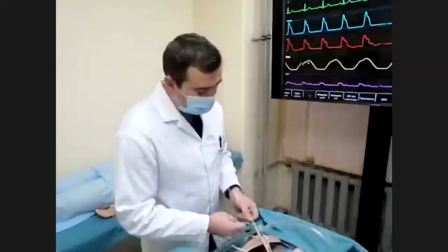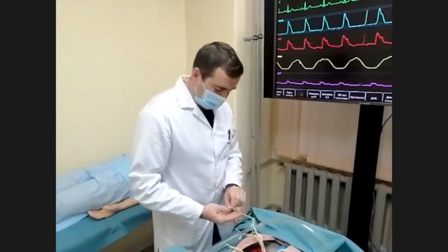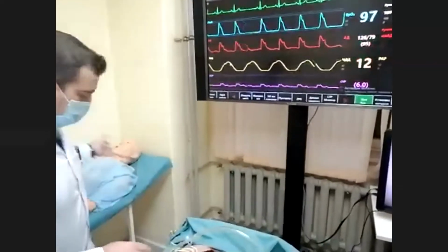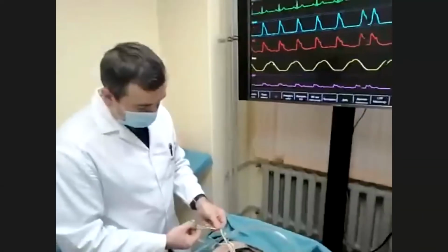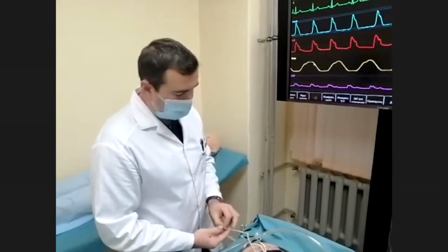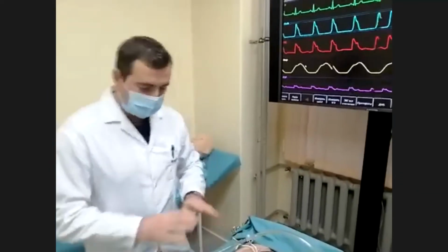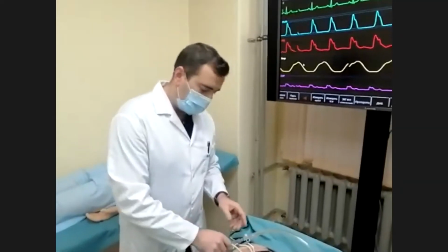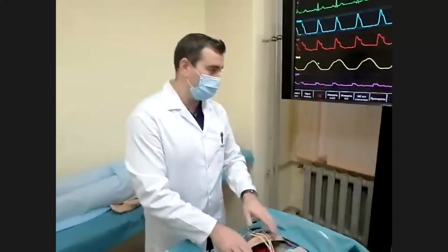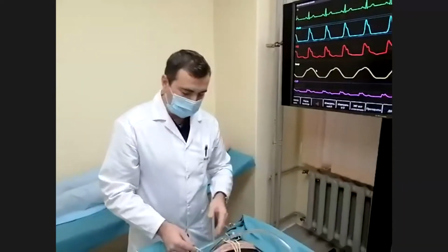It's synchronized by a human who is an operator sitting near the computer of the robot, and he watches what we do, and he is able to give us any situation, and there is no direct connection to the electronic device.